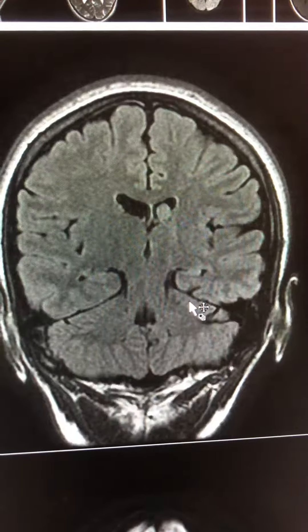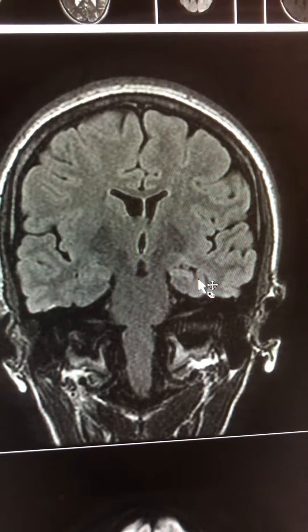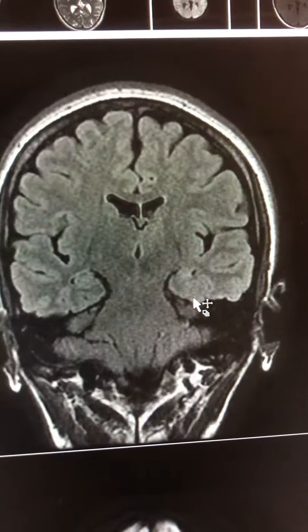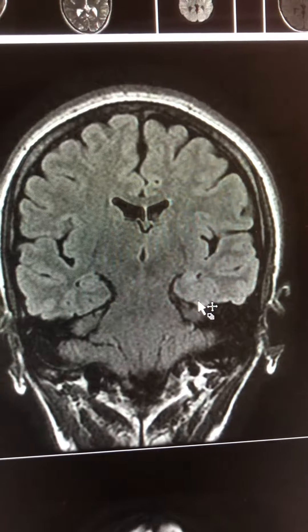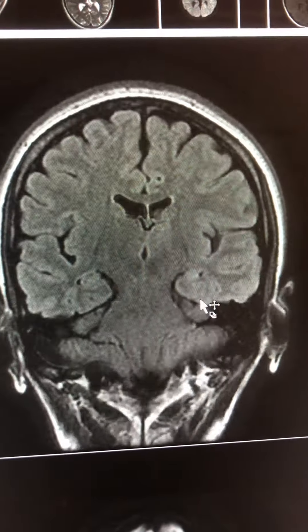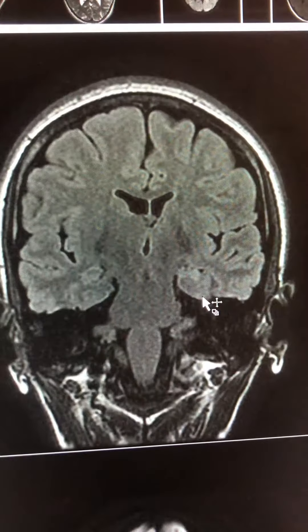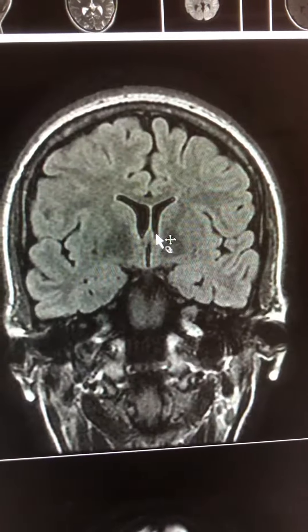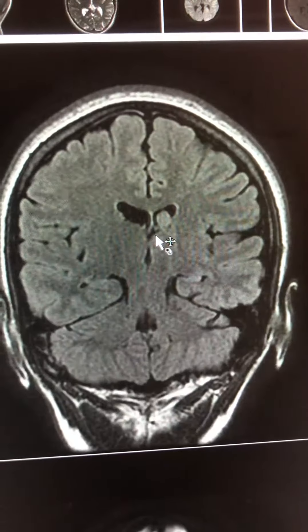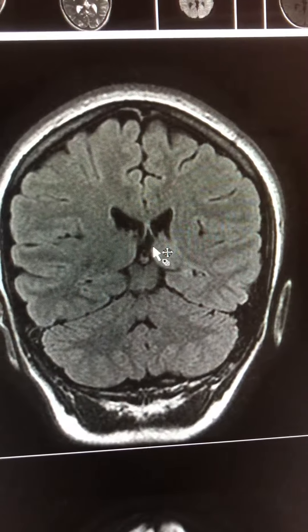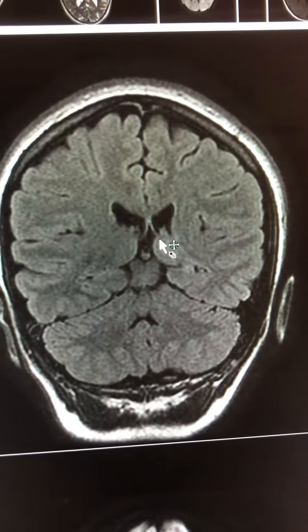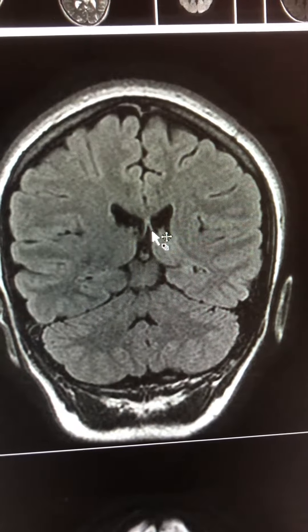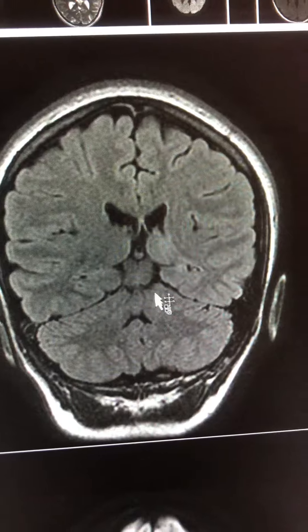Sometimes we also find some dilatation of the temporal horn of the lateral ventricle, which is another secondary sign. We also look at the fornix — sometimes we see thinning, and here you can see asymmetric thinning of the fornix on the left compared to the right.